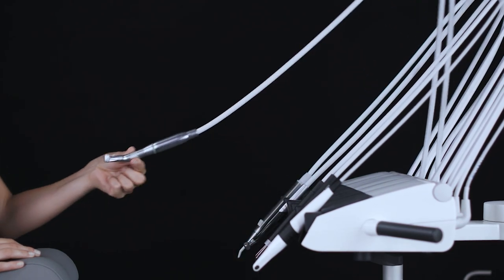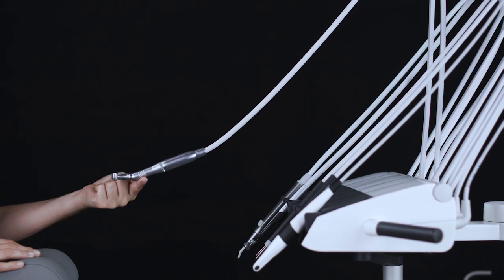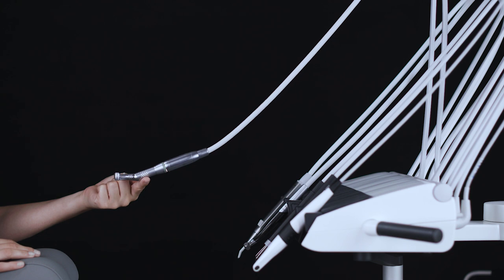Each instrument's suspension is fitted with a spring that can be adjusted so that the instrument is perfectly balanced.